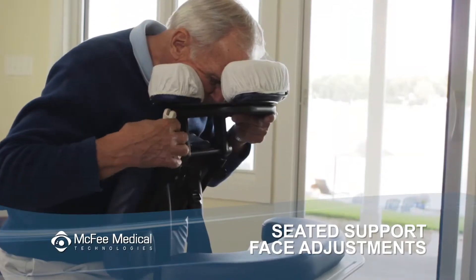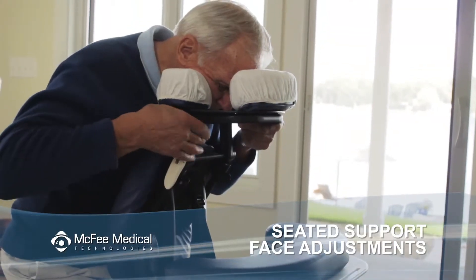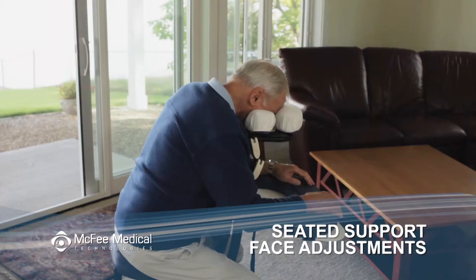When you've found a comfortable and accurate face down position, lock the cam locks in place. They do require a little force to lock and unlock. If you're a little shorter, you may find that moving the face rest back towards you may be the best way to find a comfortable position.